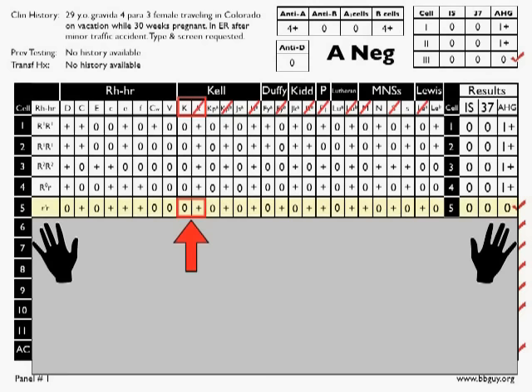Okay, once we get to the RH system, things get a little weird. So hang with me here. We've got several antigens along the end of the RH system, and this is typically where they are on a panel, such as V, CW, and f, that don't have any pairs on the panel. So we just look at V individually. Obviously, there's no antigen there, so there's nothing to cross off. Same thing with CW.